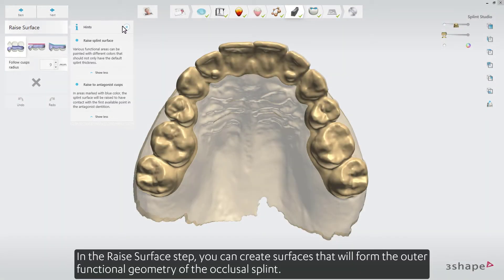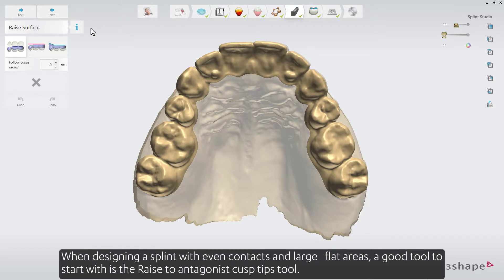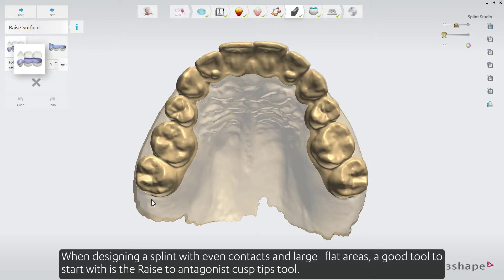In the Raise Surface step, you can create surfaces that will form the outer functional geometry of the occlusal splint. When designing a splint with even contacts and large flat areas, a good tool to start with is the Raise to Antagonist Cusp Tips tool.